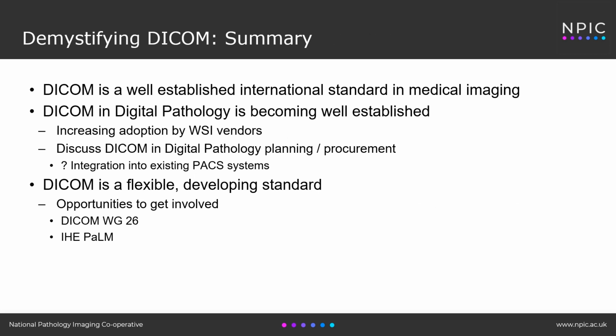So that's about all I've got to say on DICOM today. And just to finish with a summary, DICOM is a well-established international standard in medical imaging. And indeed it's becoming well established in digital pathology by increasing adoption by whole slide imaging vendors.